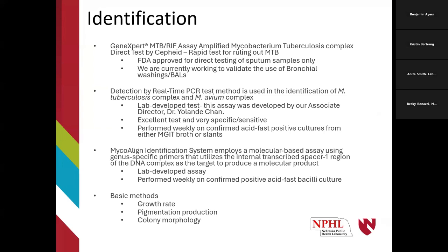It does identify M. tuberculosis complex and M. avium complex. This was developed to replace the AccuProbes from Hologic that they discontinued. So we are just so grateful that we have this test. It's an excellent test and very specific and sensitive. We perform this test weekly on confirmed positives, either, like I said, from the MGIT or from the slants. Again, we only do this once per week. The reagents are costly and the test is very time consuming.